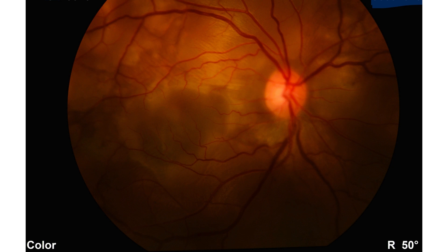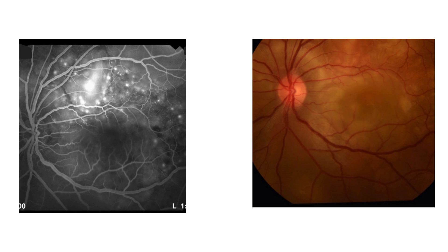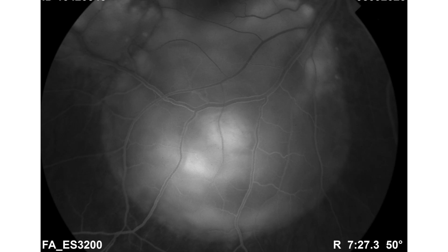We started our investigation and went for the FFA. In the FFA findings, you can see on the right side there is a fundus photograph, and on the left there are multifocal areas of pinpoint leakage — hyperfluorescent areas — corresponding to the right fundus photograph. This is another well-localized area where we can see central pooling of the dye with focal leakage areas.